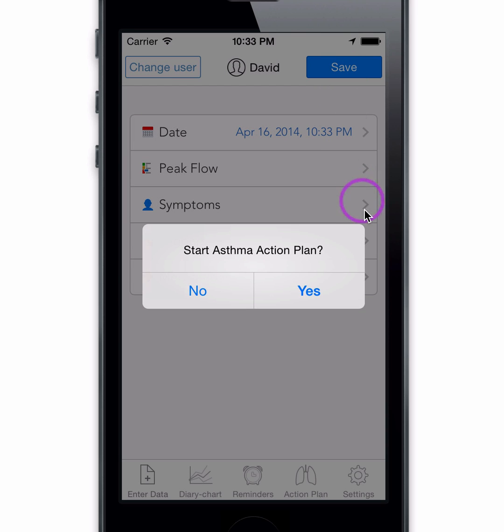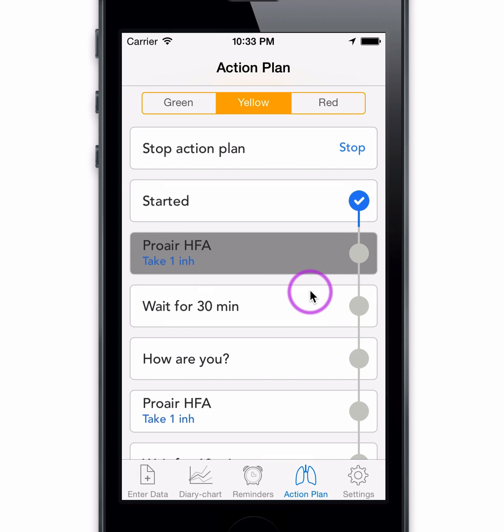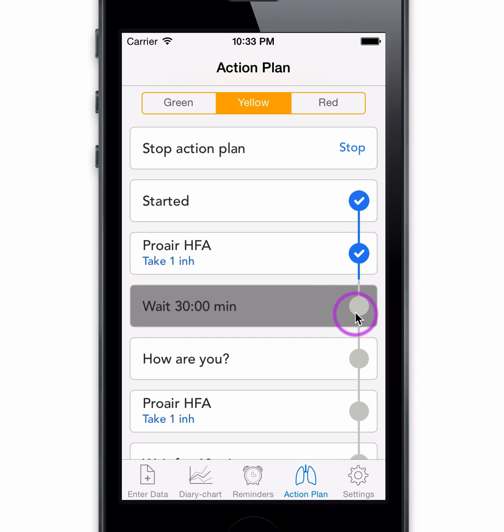By tapping the save button, this information is saved in your diary. For those with an action plan, if you happen to enter a peak flow value in the yellow zone, the action plan is triggered and will direct you through the process one step at a time. The app will remind you to take your rescue medication. Once you do, check the bubble. The app will remind you to recheck yourself after a certain amount of time, following the recommended NIH asthma guidelines.